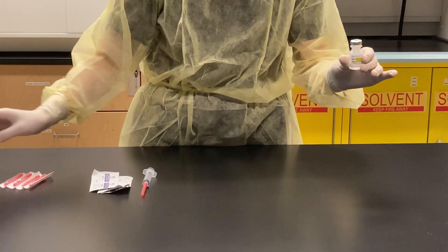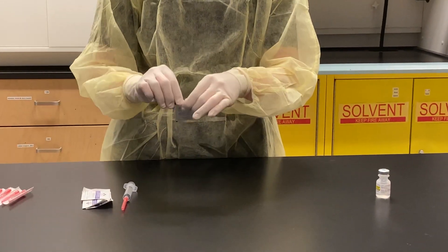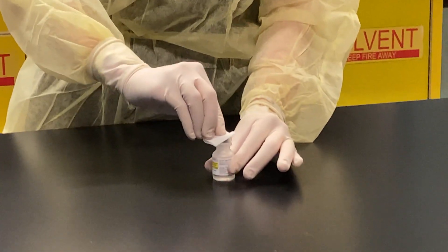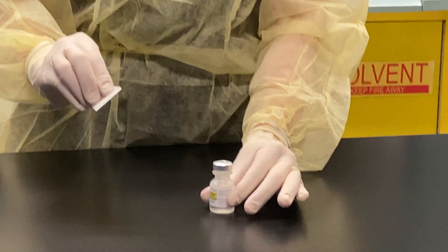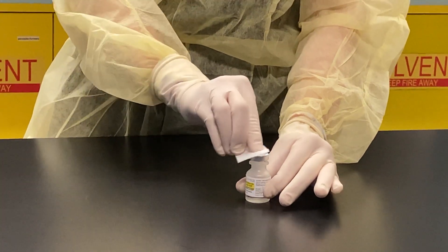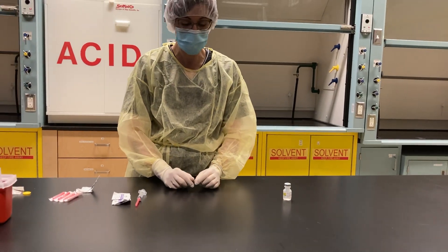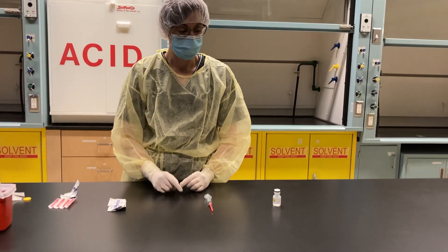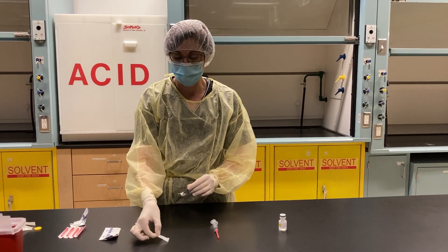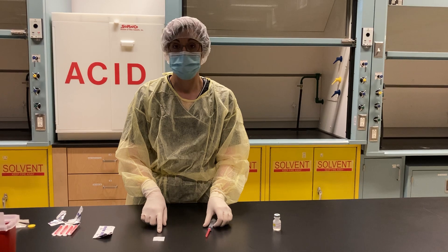Next I'm going to take the flip top cap off my sodium chloride. Take an alcohol swab and swipe either towards the back of the hood if it is a vertical laminar airflow hood or biological safety cabinet, or towards the side if it's a horizontal hood. Now I'm going to let that dry. I'm going to take another alcohol swab and put it on my work surface, and this is for putting my needle cap on so that it stays sterile.